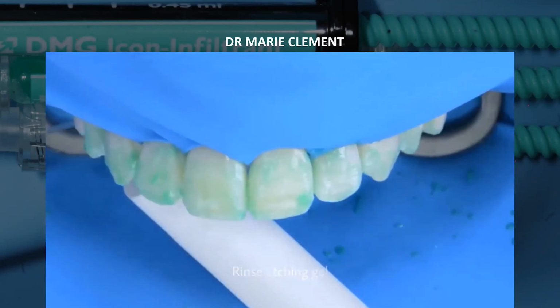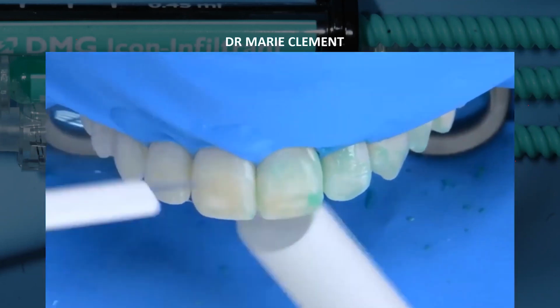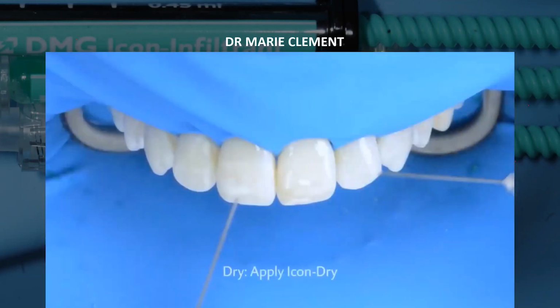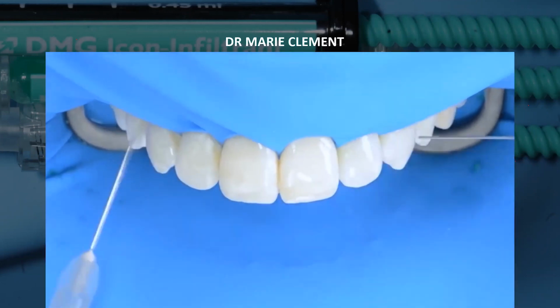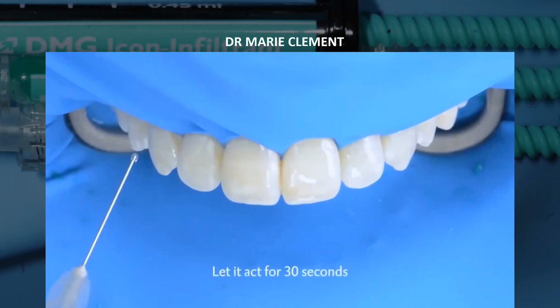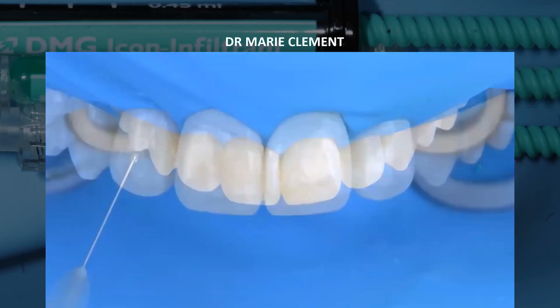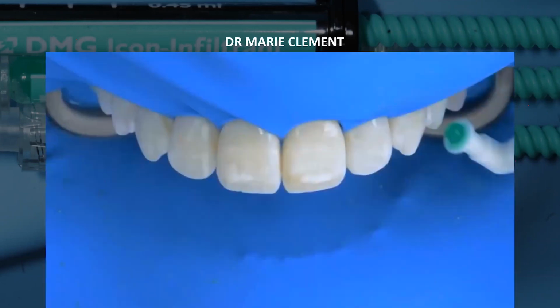Give that a rinse. That's the Icon Dry being applied there. Now she's actually using syringes there. You do get an application tip that's sort of like a round brush to use with the Icon kit, but leave that to work.